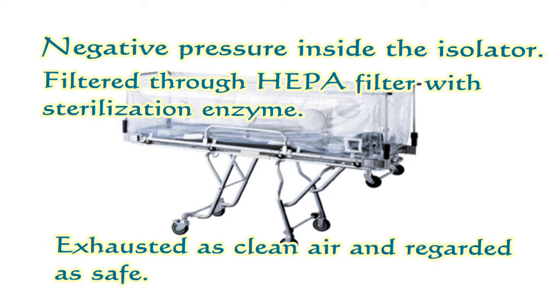This product maintains the negative pressure inside the isolator, and the inside air is filtered through a HEPA filter with a sterilization function and is exhausted as clean air. So, exhausted air is regarded as safe.